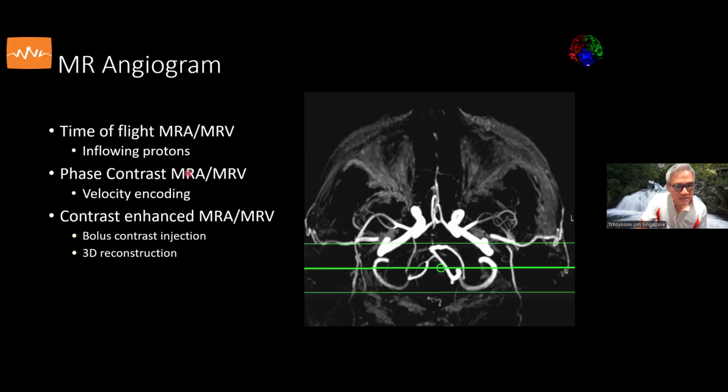without necessitating contrast injections. And we may need to recall the patient if we are unsure for contrast-enhanced MRA, or even proceed to a CT angiogram or digital subtraction angiogram. So there are many choices. There are many different types of pulse sequences that are selected according to what the vendor has prepared, and you'll come across them in your practicum, I think.